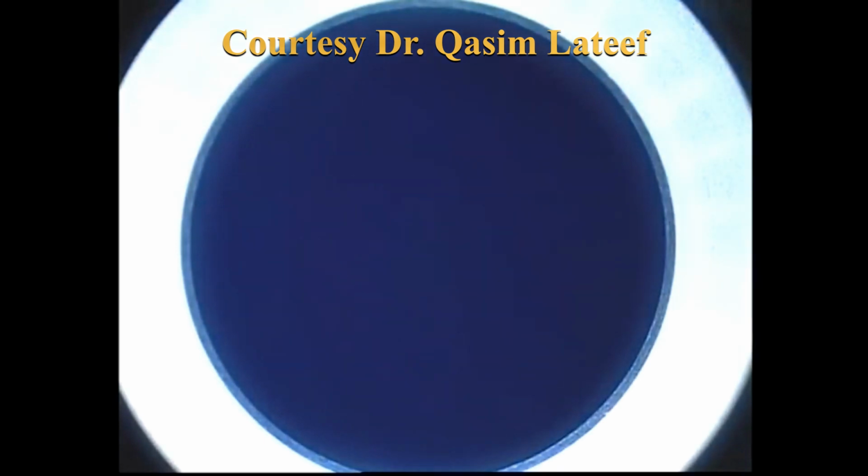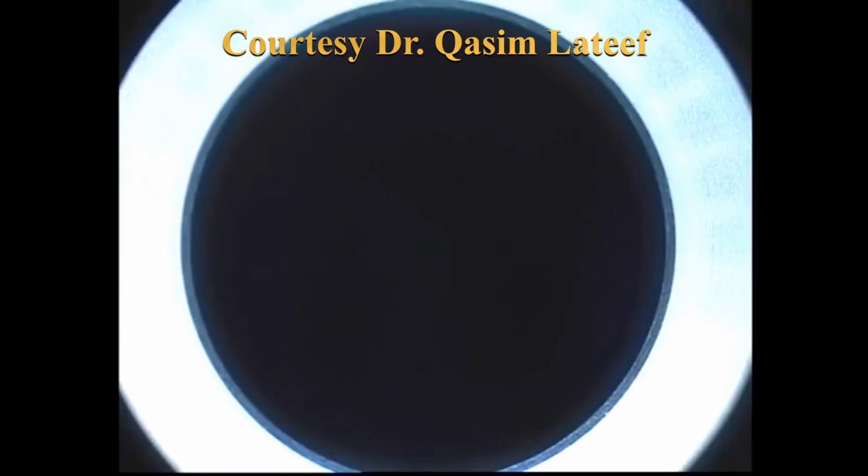Here we're going to show you a clip of the SMILE procedure. You're looking through the contact lens of the femtosecond laser. You're seeing it through the operating microscope, and you can see the light blinking over there, and the contact lens is going to be gradually lowered onto the cornea. So you have to be very precise, bringing it down so it touches the surface of the cornea, and as soon as it touches, you will see a wave of fluid which goes away from in between the cornea and the lens, and you've got contact.